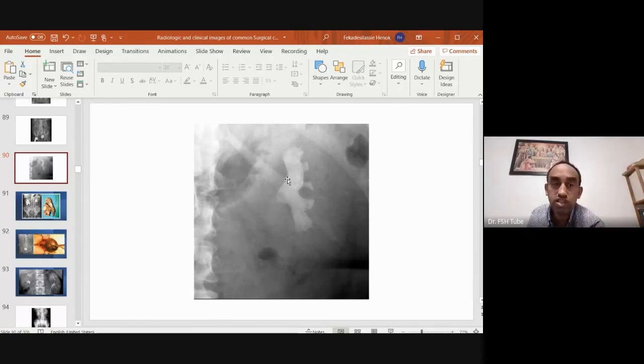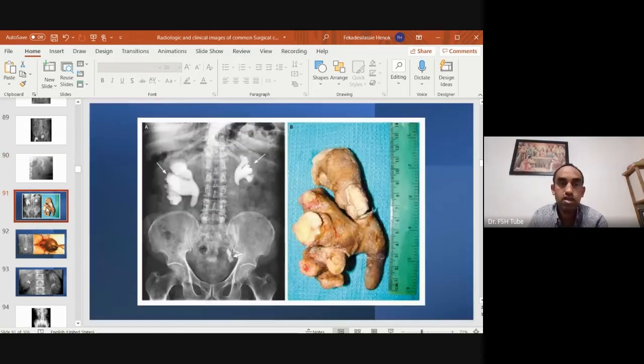But if somebody tells you this is a plain abdominal X-ray and you see this, this is a Staghorn calculi. You can see there is no contrast. You can see Staghorn calculi bilaterally, and this is how it appears. If it was a contrast study, not a stone, this is hydronephrosis, right? Bilateral hydronephrosis, and probably PUJ obstruction or proximal ureteric obstruction because you don't see any contrast going down. If it was a contrast study, but this is a plain study. And there is another one, most probably another stone down there. So Staghorn calculi in the right, Staghorn calculi in the left. Very unfortunate to the patient.